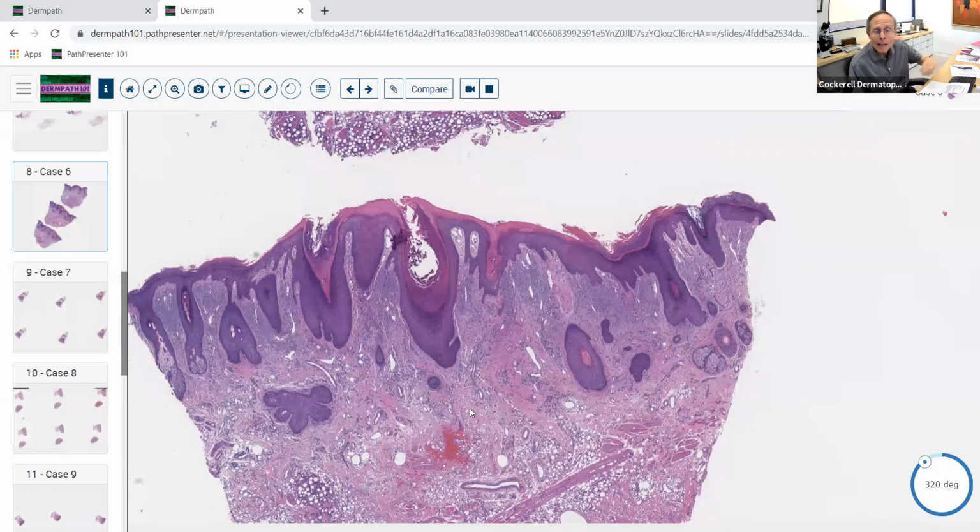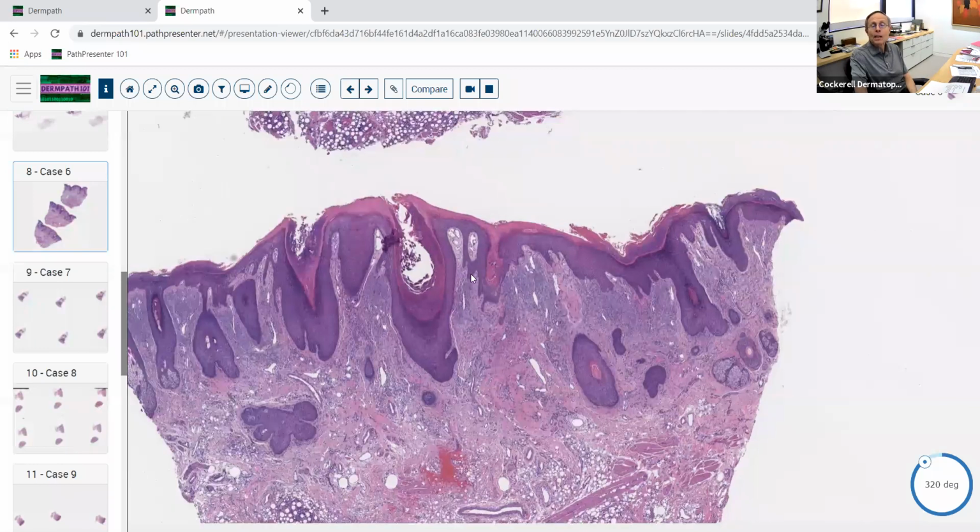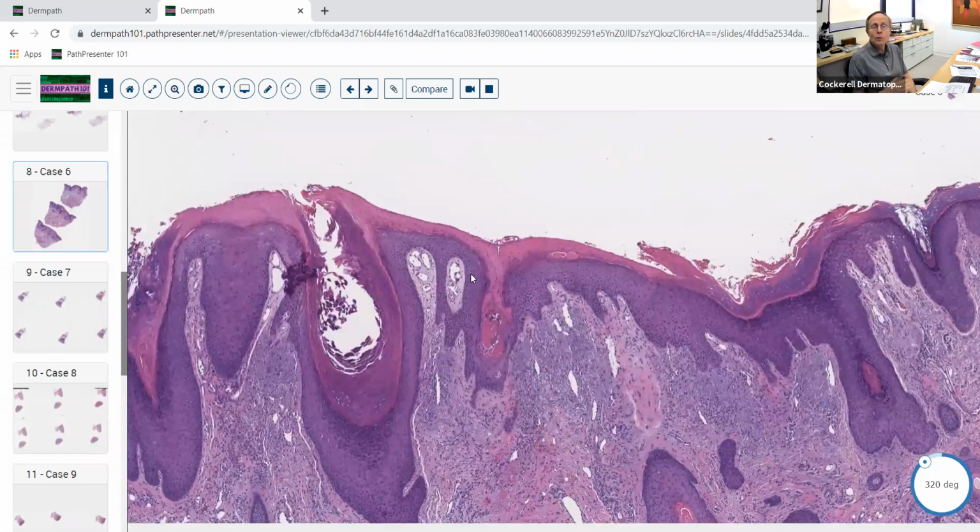And how do I know that? Well, because you have hair follicles here. Whenever you have hair follicles plus a markedly thickened cornified layer, there's really only two conclusions. One, you're dealing with a gorilla, where they still have hair follicles in their palms and soles, or you're dealing with lichen simplex chronicus. And so we've got that in this situation. The person was rubbing the area. They didn't like what they were feeling here. And what is it that they didn't like?